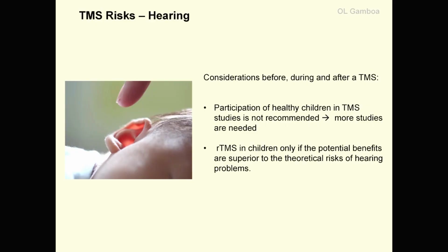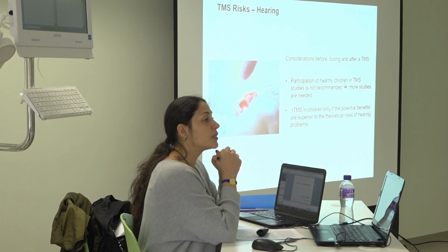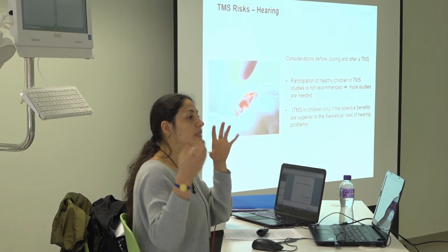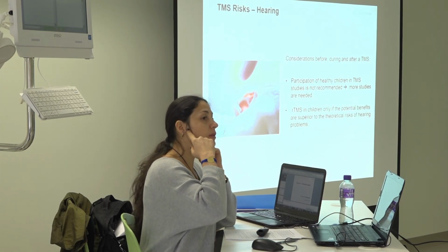Another thing about hearing is about healthy children. It's not known what can happen, but it's not recommended, because they are still in development, and it's possible that TMS causes damage in the ear.